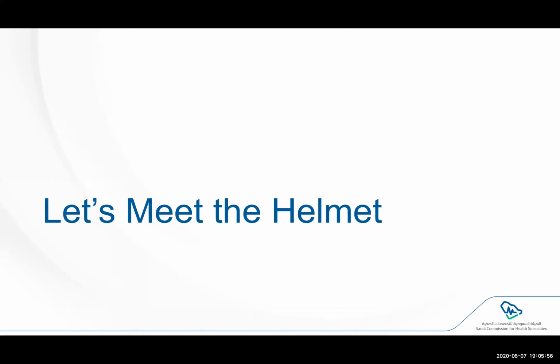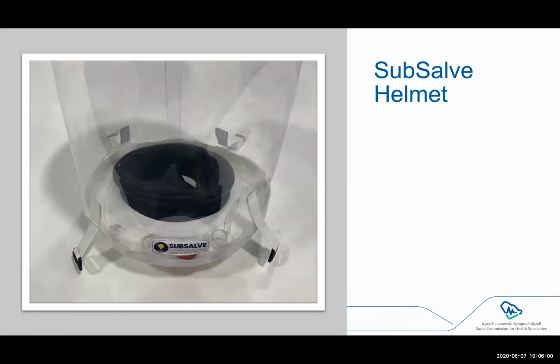I would like us all to meet the helmet. So the helmet that has been distributed all over the kingdom is the Subsalve helmet, which you see the picture of right now. So basically it's a transparent helmet or bubble, and it has a base, which is the white one, which is very flexible, and a neck collar that is adjustable and made of latex or silicone, and two shoulder straps.